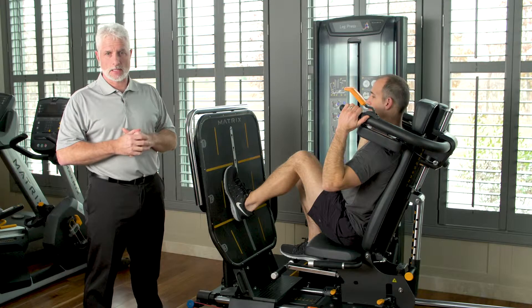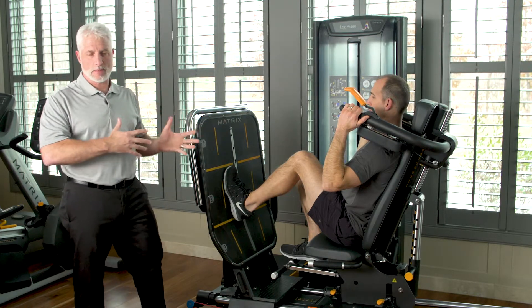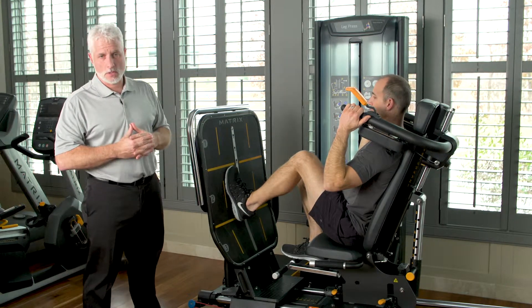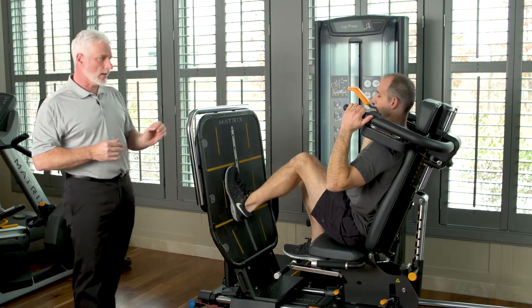In our case we have a patient demonstrating as if he had an ACL reconstruction. What we're going to demonstrate is a rebound technique that you can use when rehabbing this patient population.